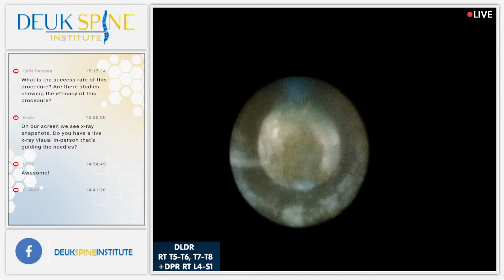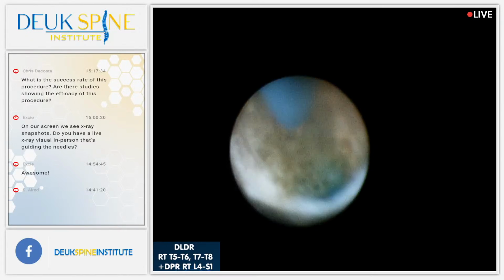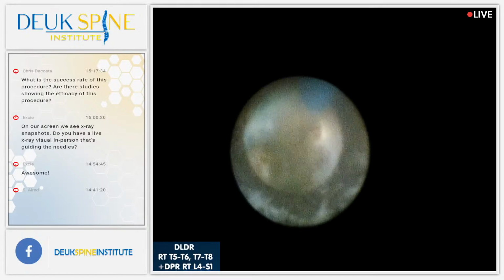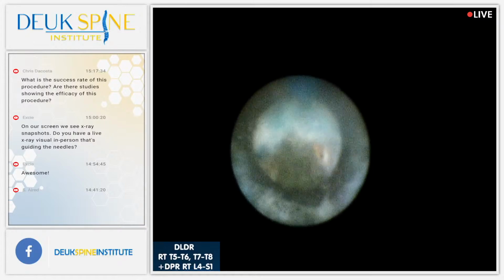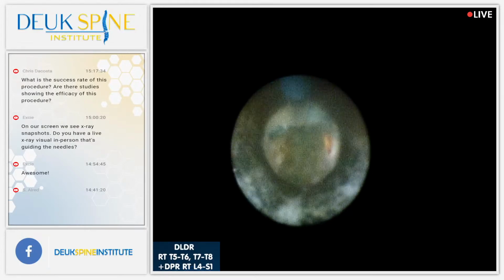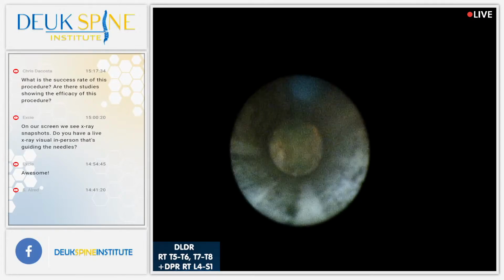Yeah, Chris, there are. We published our results for the Duke laser disc repair for the thoracic. This particular surgery, 99% thoracic pain eliminated. 99%. And that was at 13 months after surgery. So we asked our patients we did this to, hey, how much of your pain did we get rid of? And they said 99%. That was the average. So it's extremely effective. All right, we're outside the disc.